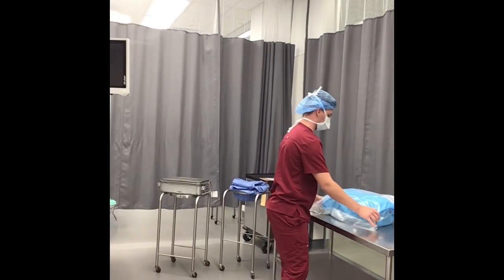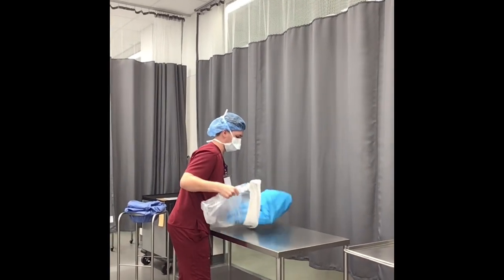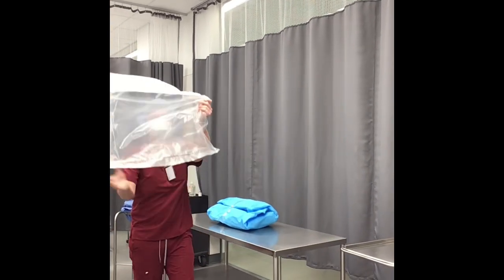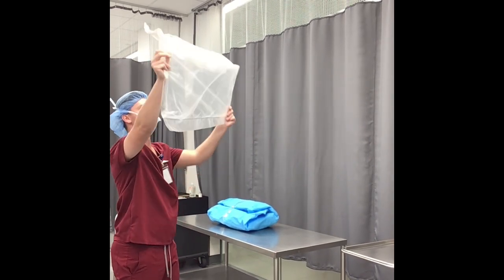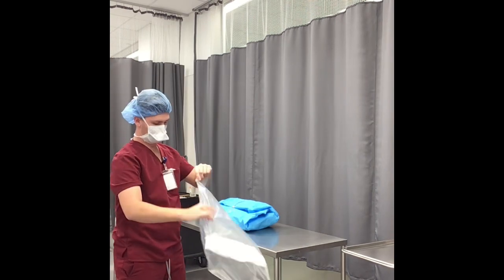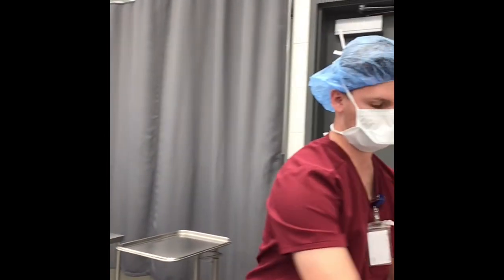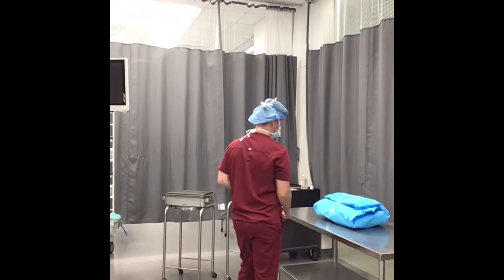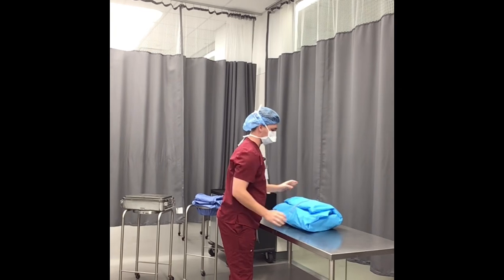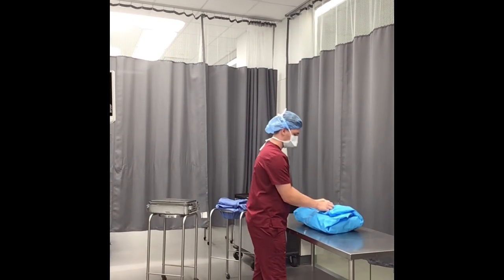Okay, so this is when I'm going to go ahead and remove my laparotomy pack from my dust cover here. I'm going to go ahead and check my dust cover for any holes or rips or tears or anything that would compromise the integrity of the package. If it did have a hole in it or a tear, then I would have to get a new pack. Okay? All right. So at this point, I'm going to go ahead and open up my back table cover. Okay? So this is when your 30 minutes starts.